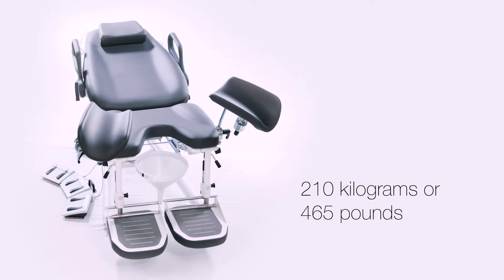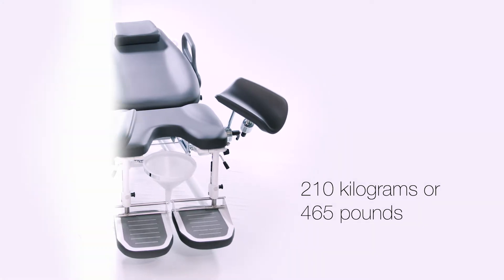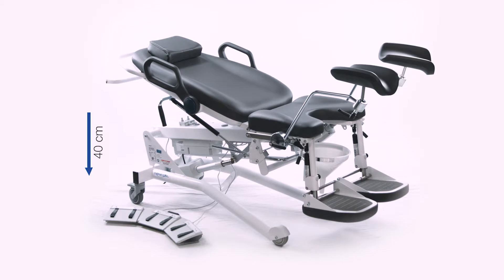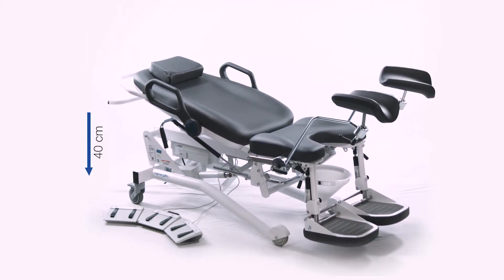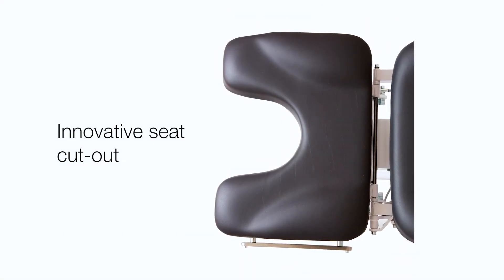The S2 chair can support up to 170 kilograms or 375 pounds. The S3 chair can support up to 210 kilograms or 465 pounds, and can be lowered to a seat height of 40 centimeters or 16 inches. This adaptability makes the S3 chair suitable for bariatric and disabled patients.